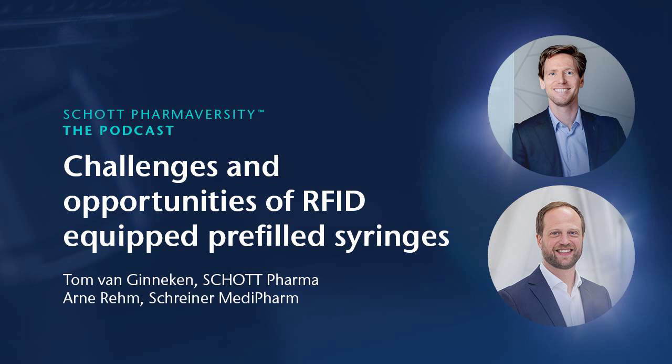And therefore, we spend quite a lot of time optimizing and tuning the RFID inlay, not only for the syringes themselves, but also for the potential contents and all the other variables that might have an influence. However, these scenarios were not only tested in the lab, but also in cooperation with equipment manufacturers. So the RFID equipment that could be used in the hospital to read out these syringes, and also along the line when processing the syringes.